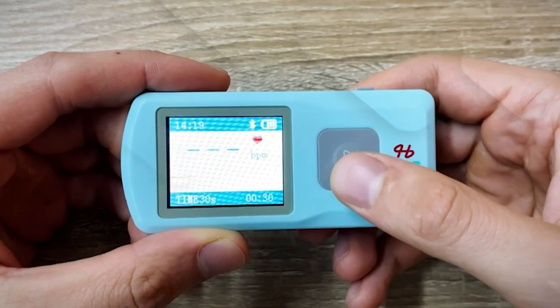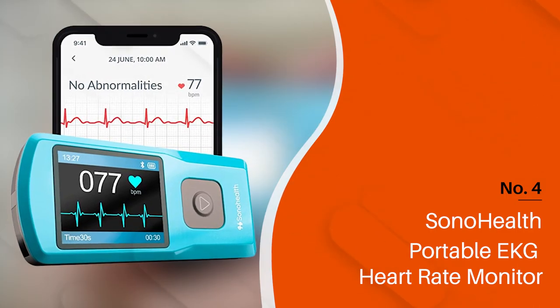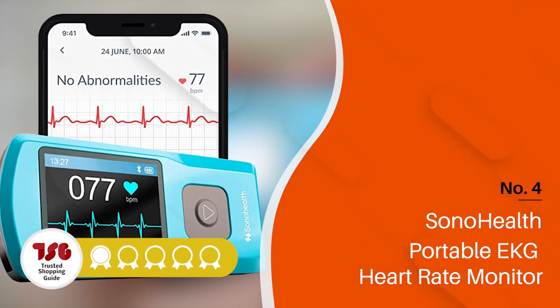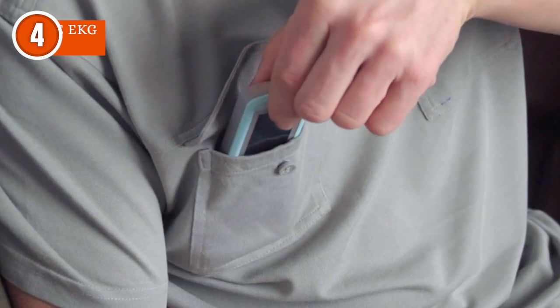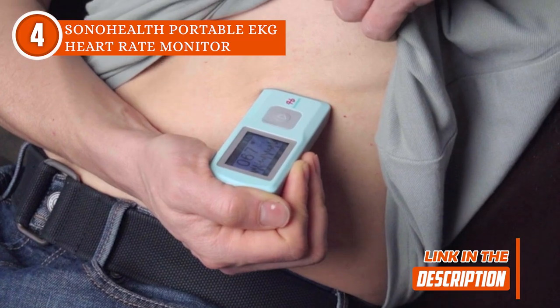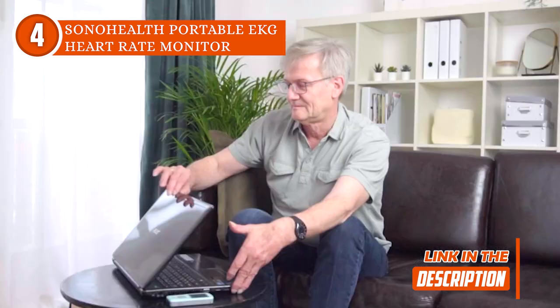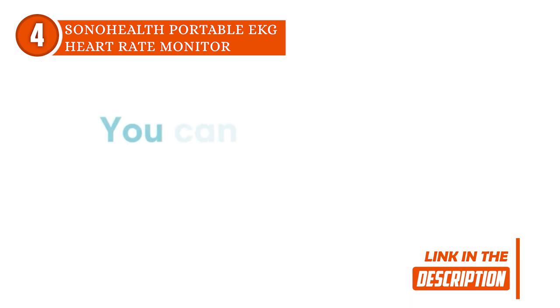The fourth personal EKG monitor on our list is the SonoHealth Portable EKG Heart Rate Monitor, which TrustedShoppingGuide.com has awarded a 4-badge rating. There is no better way to keep track of your heart health than with the SonoHealth Portable EKG Heart Rate Monitor. This portable heart rate EKG monitor has many sensors that enable more accurate measurements and readings. All you need to do is touch your fingertips to the sensor to begin tracking.